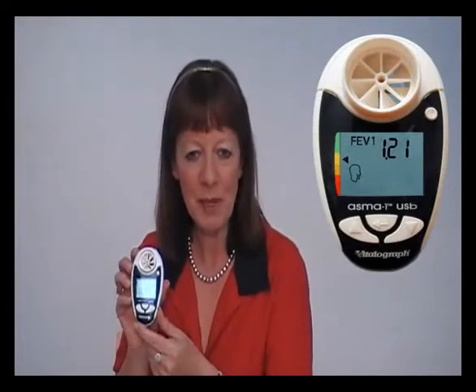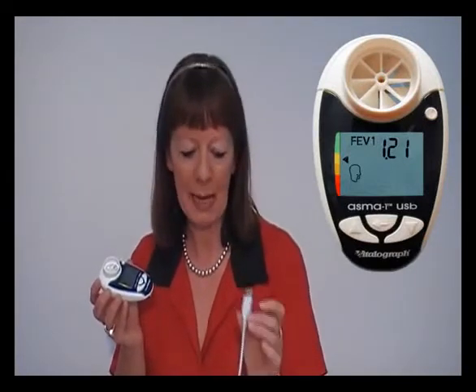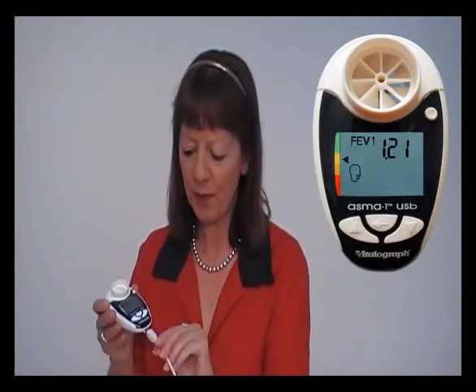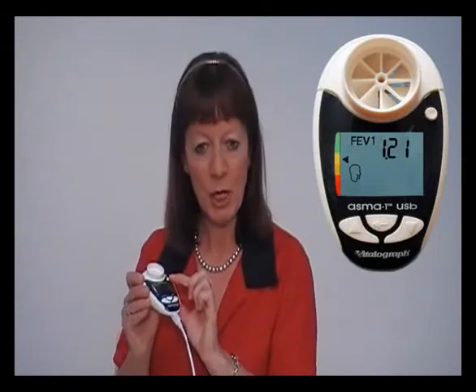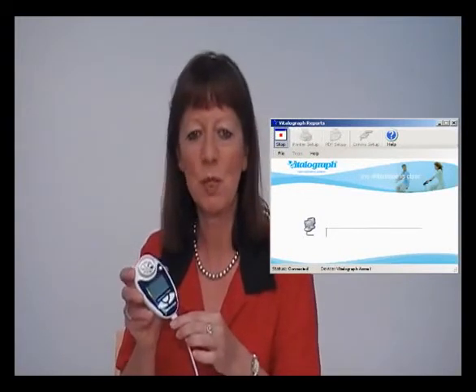If you have the USB version of the AsthmaOne, you will be able to download the data to your computer using the USB cable supplied with the product. You will also have VitalGraph reports software supplied and loaded onto your PC. Simply attach the cable to the USB port of your PC and the other end to the base of the AsthmaOne device. Using the circular button, switch the AsthmaOne on and look for the transmit icon. With this icon showing and VitalGraph reports software running on your PC, just press the enter button and the test results will automatically transmit.